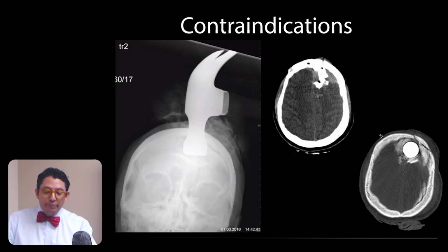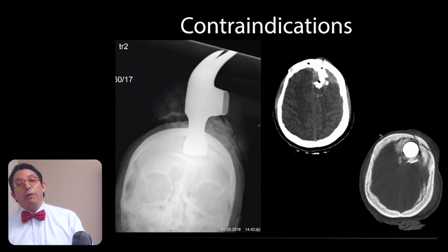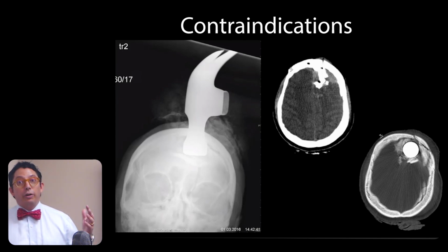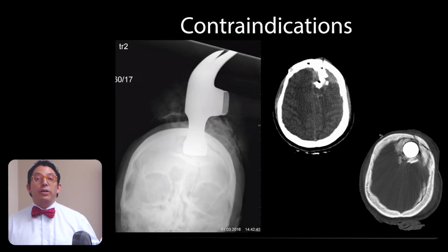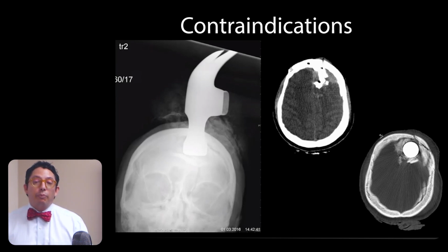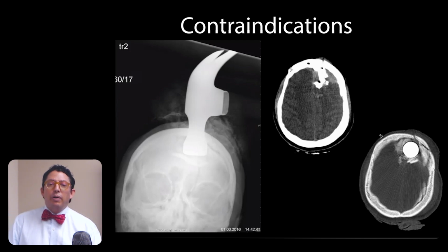So you at least have to think about that, even though you don't have to know all the differential diagnosis for now. Other things that you have to know is that with imaging, there's some contraindications for some of the images we're going to do. And today we're going to talk about contraindications for MRI. One of the biggest contraindications when you go to the next step after CT, which is MRI, is metal, right? Of course, not always is that you have a hammer stuck into your skull like this one, but when you have big pieces of metal, because you're in a magnet that, remember, can be up to 60,000 times the magnetism of the Earth. If it moves, it becomes a projectile. It can heat up and it can cause a worse lesion to your patient. You have to understand that some metal and metallic implants are important when you're doing these type of studies.